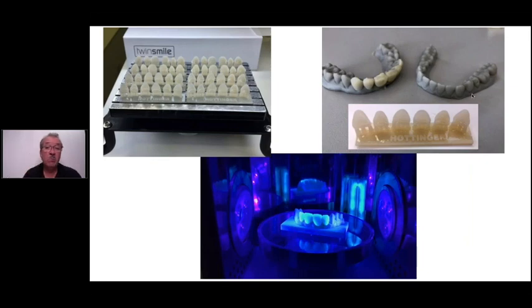Something else also, if you're making models which are hollow inside and you want to thermoform something over it, you have to be careful, because what happens is the models implode into themselves. So if we know we're going to thermoform something, we just pour a little bit of plaster back into the model, so it doesn't implode, because we want to keep these models as light as possible.